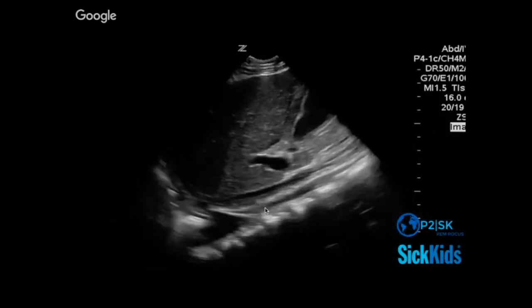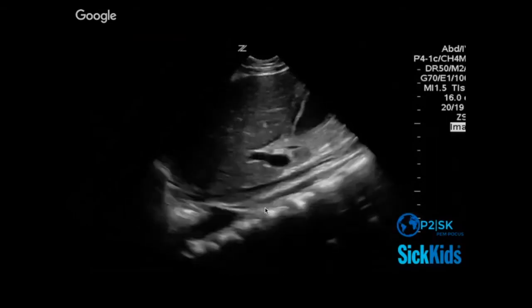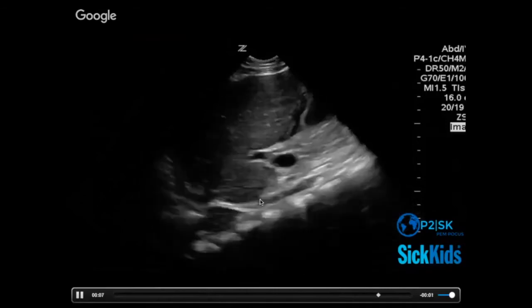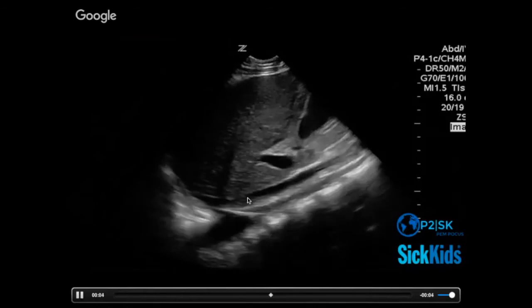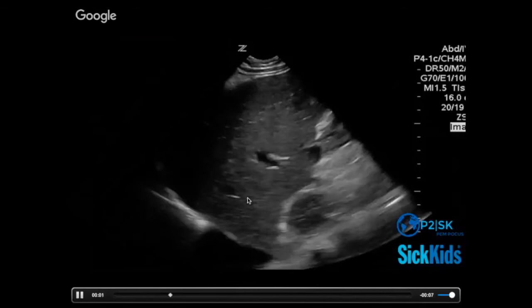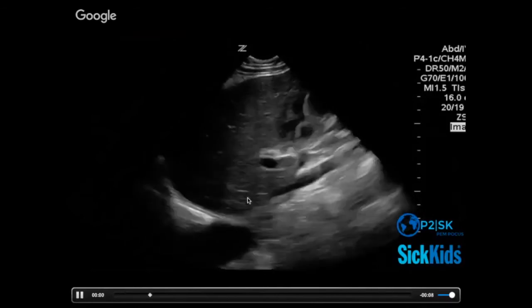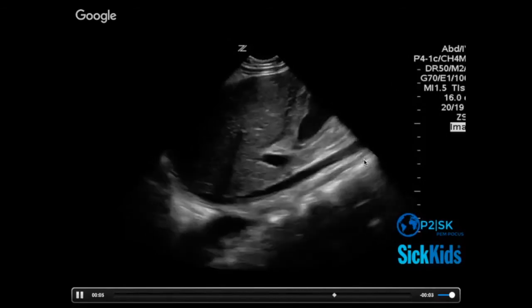Do you see the IVC? Yeah, but right. I would say like on the pleural side. It's not collapsing. Not collapsing, let's say. This guy here, hey? Yeah. Big? Yeah. I would say decent. You think it's plethoric? It's not collapsing. Let's say that. Okay. But that's plethoric. Something. Okay. Is there anything else to see in this shot? We don't see the hepatic. You don't see the dilated hepatic vein or something?